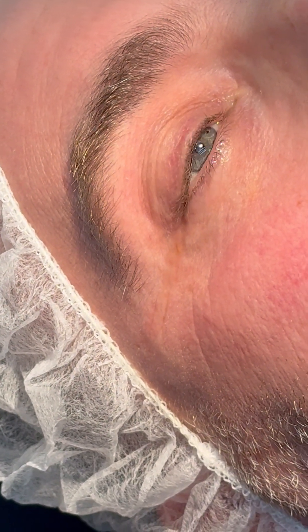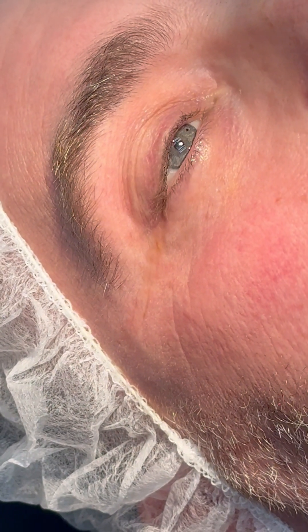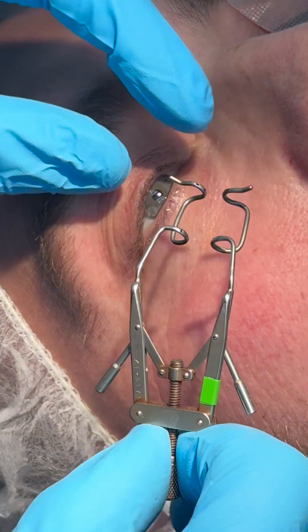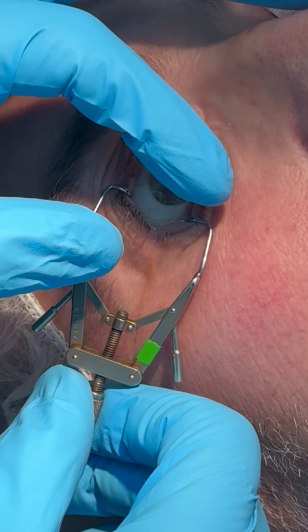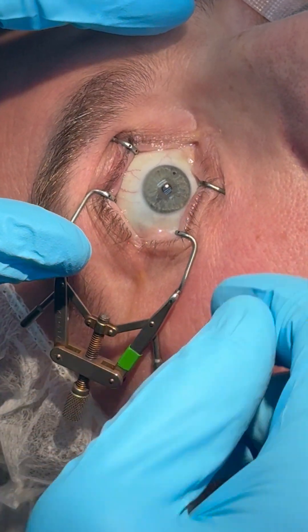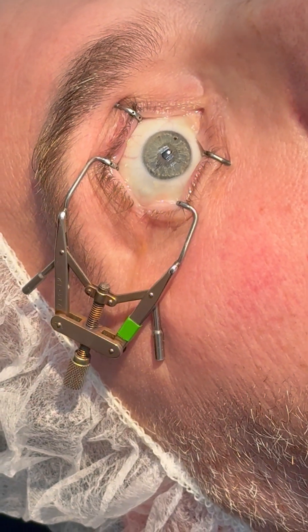So once he's numb, this patient has already had an IPL with expression. He has conjunctivochalasis, which I took a video of to show you before you see this technique. I'm going to put a little lid speculum here. His conjunctivochalasis goes from medial all the way to temporal. If you have somebody that is nasal to temporal, you're going to go ahead and give them the numbing lidocaine all the way through. So this is a little bit of lidocaine with epinephrine.